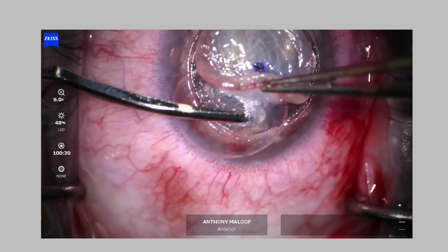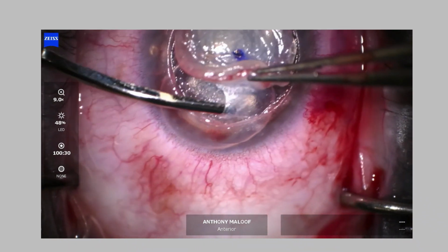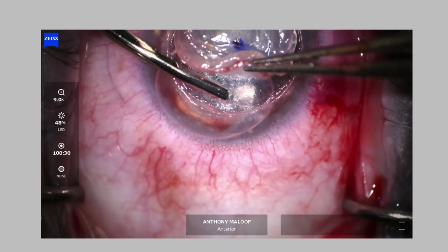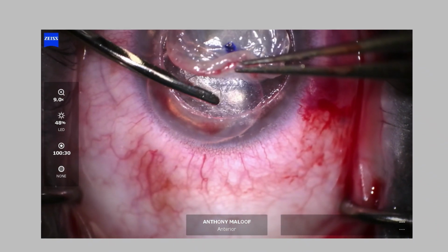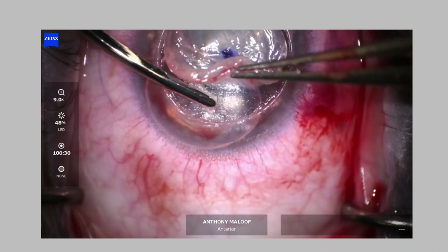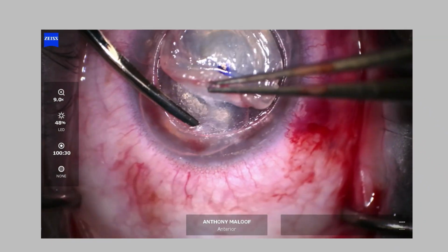Here you can see now I'm using my left hand to come backwards. Whichever plane opens up is the plane you follow. People often ask me, oh, how do you get to the plane? You don't, you make it. It's like making your own track through a forest. If there's no track there, you make it. And soon everyone can follow.